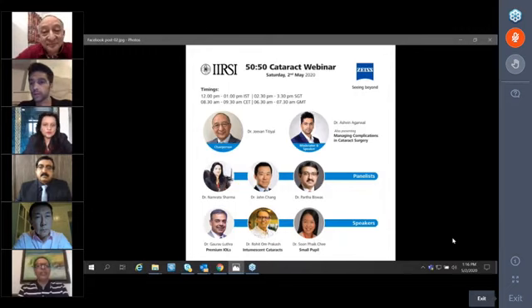Can I just add here? Yes, Dr. Phaik Soon. So, instead of taking out the IOL together with the CTR, which requires a large incision, I will hold onto the CTR and move it hand over hand until I reach where the CTR begins or ends. I'll use the scissors to just snip on the bag and then get hold of the CTR and pull it out of the bag. So that will reduce the size of your incision when you take the IOL out.